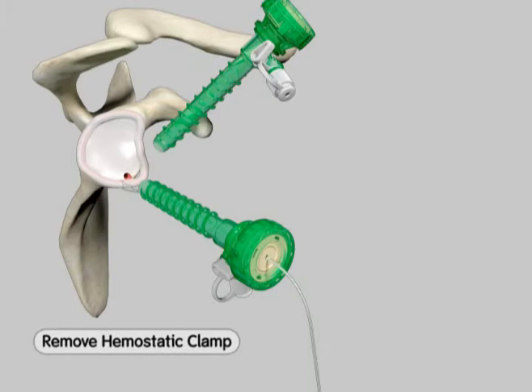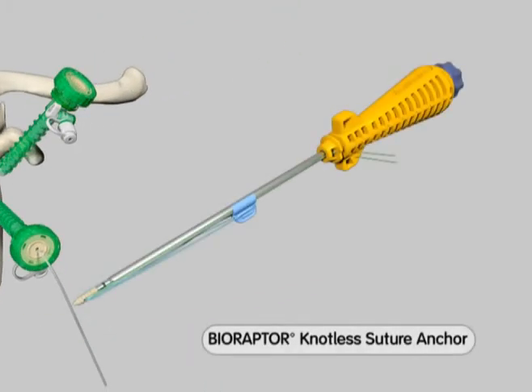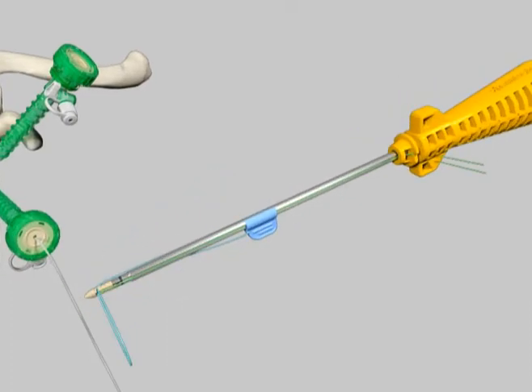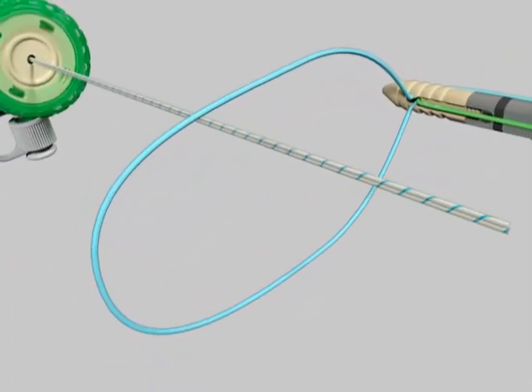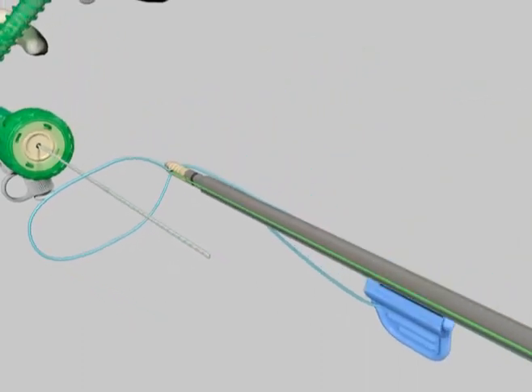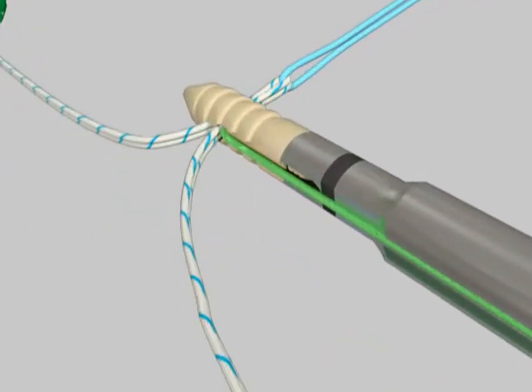Unclip the hemostat from the sutures. While holding the anchor handle, push the suture threader tab forward to release the suture threader loop. Thread both free ends of the suture through the suture threading loop, remove the suture threader tab from the shaft of the device, and pull to feed the sutures through the anchor eyelet.